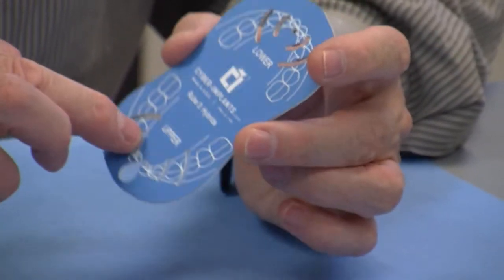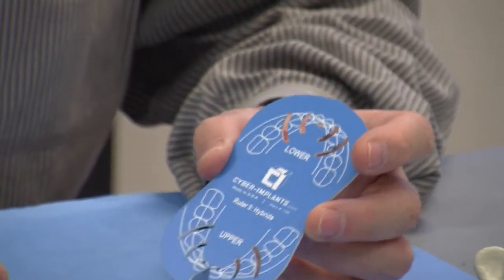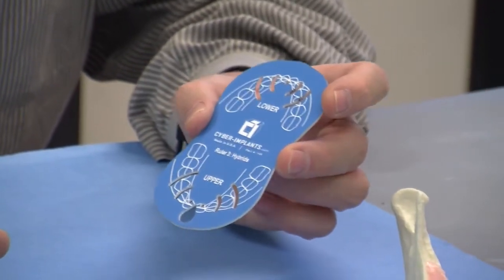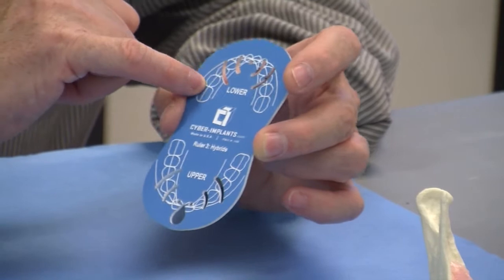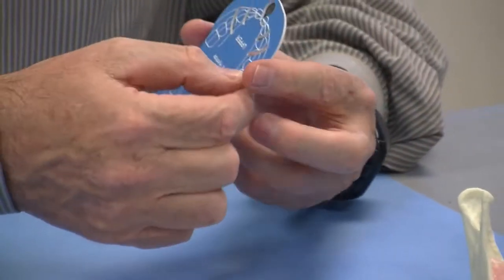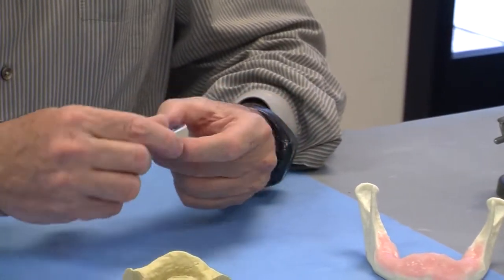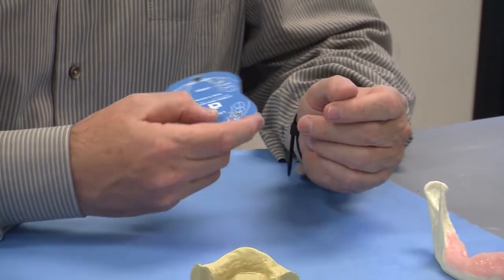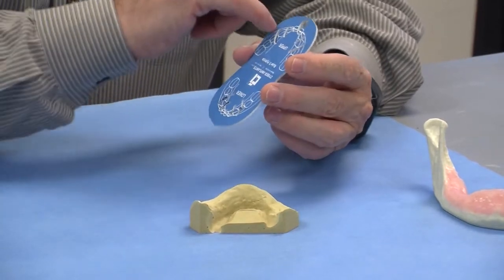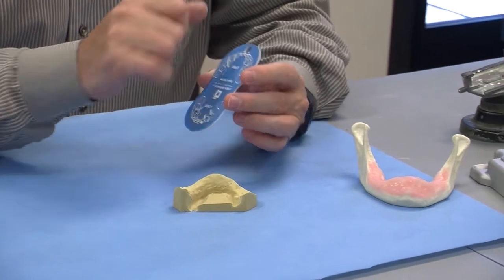Those rules apply also for mini implants, even though the distance between two mini implants is not as critical as for a regular implant. The lower case scenario is showing 5 implants, while the upper is using 6 implants. They can be used either way, but here we are going to plan for 4 mini implants. Therefore, we'll have the best 4 locations from the upper jaw.